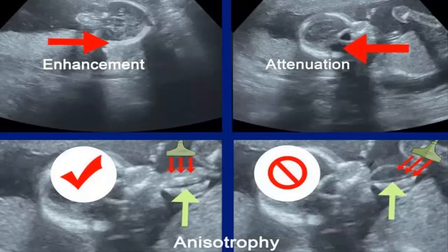5. Keep in mind that the edge of the womb may not go around the entire image. The technician may have positioned the probe in a way that centered the image on your baby. Even if you only see white or gray lines along one or two sides of the image, this is probably the outline of your womb.